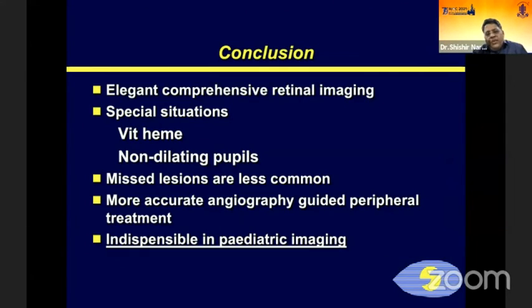So I would conclude by saying that it's a comprehensive, elegant technique, and special situations would be non-dilating pupil. Missed lesions are less, and it gives you a more accurate angiographically guided treatment, and it is indispensable in pediatric imaging.